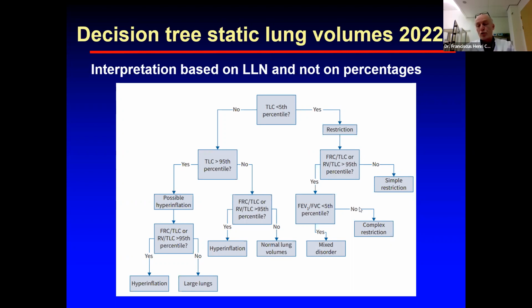Or even do an inspiratory capacity measurement: go very slow to the residual volume, then do an inspiratory vital capacity. Then you have a huge negative interpleural pressure. It opens up all your airways, and in this case you normally get the highest vital capacity. But our guidelines are based nowadays on the FVC, not on the inspiratory vital capacity.